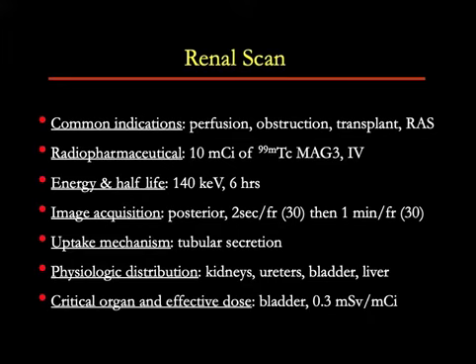Sometimes Lasix is inbuilt in the protocol and is administered by the technologist during the scan. At other institutions, the initial acquisition is reviewed and then a decision is made whether Lasix is needed or not.